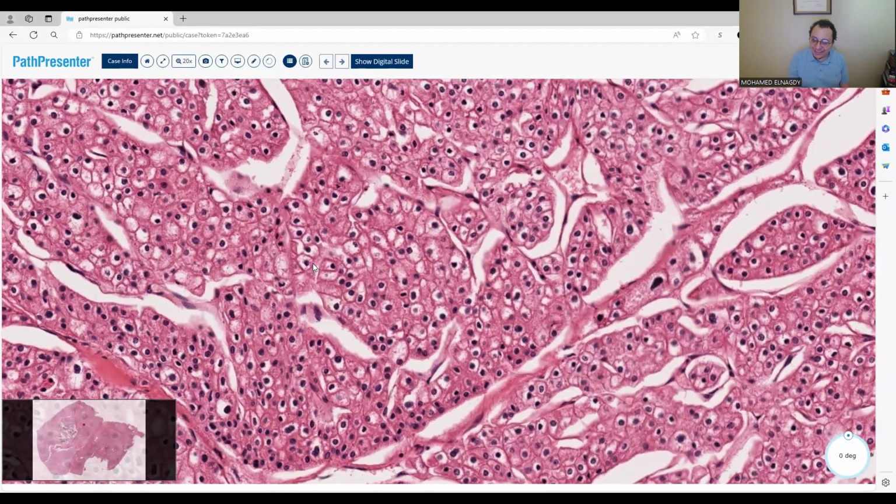What do you think here? Let's go systematically. Is it pink, blue? It is pink. And what's the cytoplasm like here? Grainy cytoplasm. I expected that, but can you comment on the cell membrane? Let me see. These look irregular. We had a word for that. Leaf-like? Yes, plant-like. Plant-like cell membrane. SDH deficient is the one with powdery cytoplasm, not the one with plant-like cell membrane.